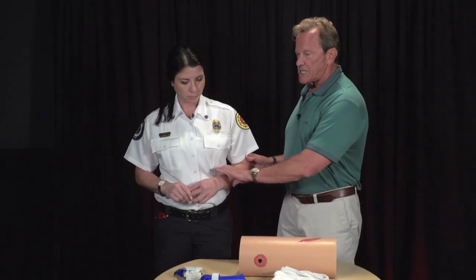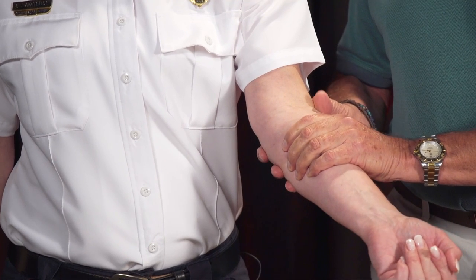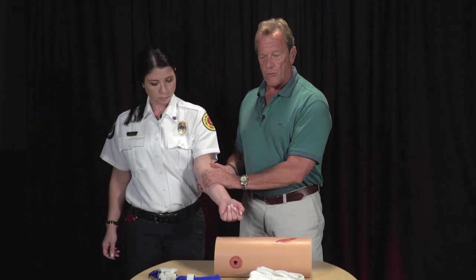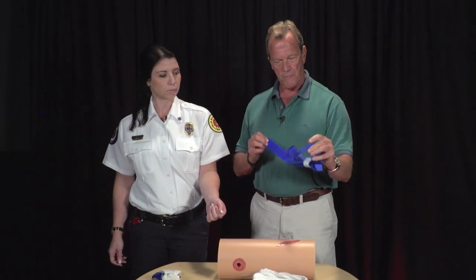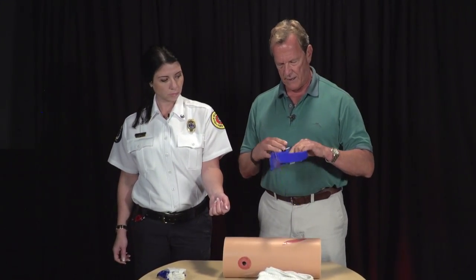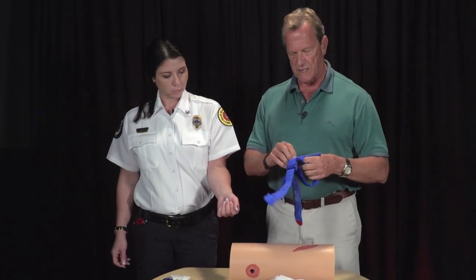Going back to Jessica's forearm laceration — I've put pressure on it but can't really stop the bleeding. So we're going to apply a tourniquet. This is a CAT tourniquet — the Combat Application Tourniquet. These are the most common ones we see here in Palm Beach County and probably the most common in the country. They were developed and used in the Middle East.